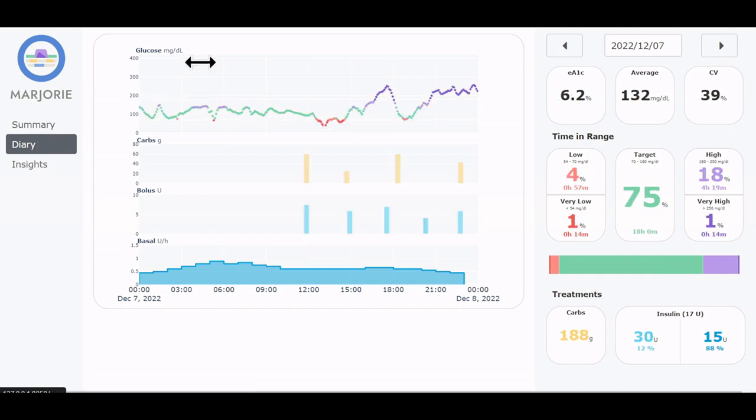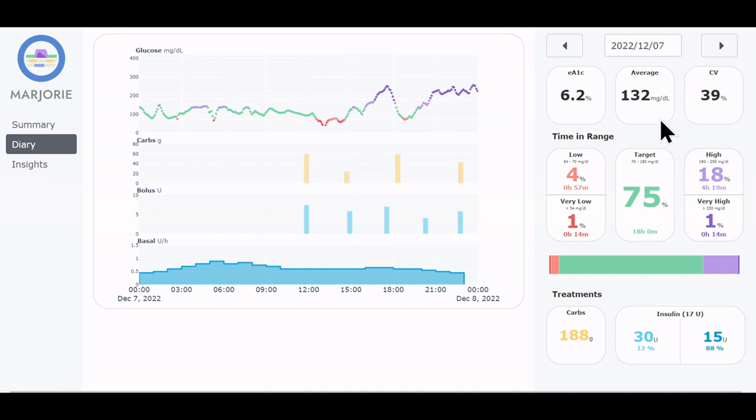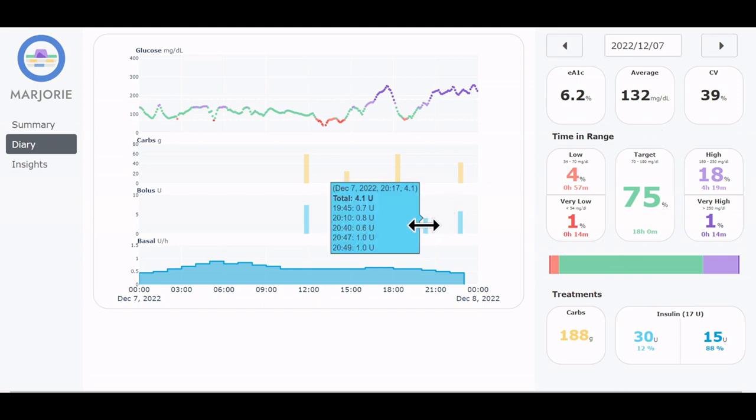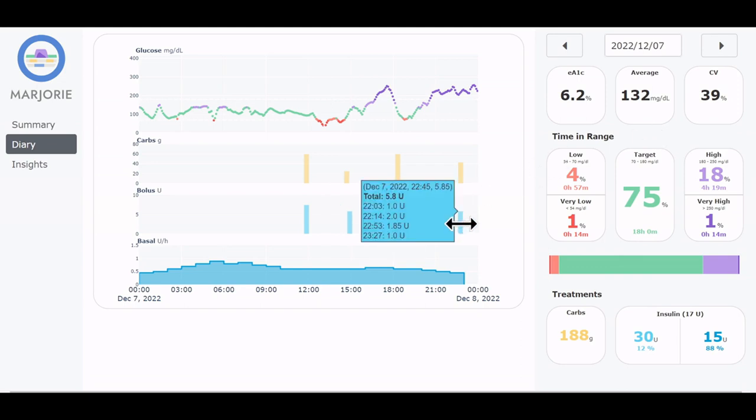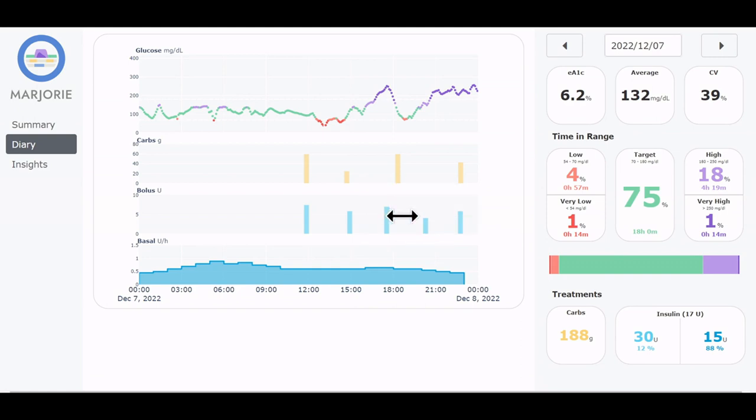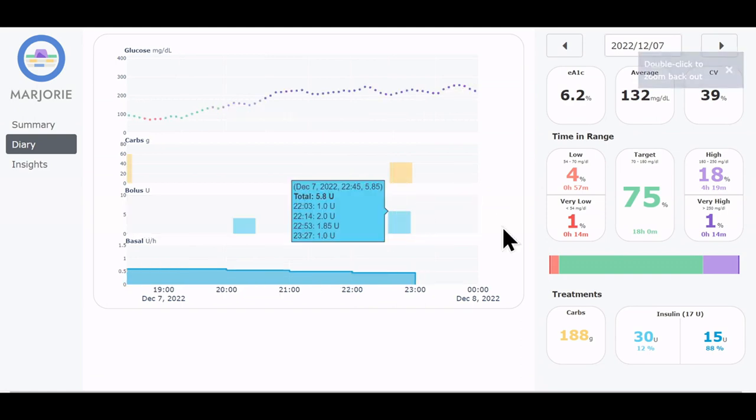Here we see the glucose along with carbohydrate, bolus and basal data, and the corresponding statistics of that day. In the bar chart, adjacent entries are summarized to prevent overplotting. And the summarized bar split up into the components when we zoom into the graph.